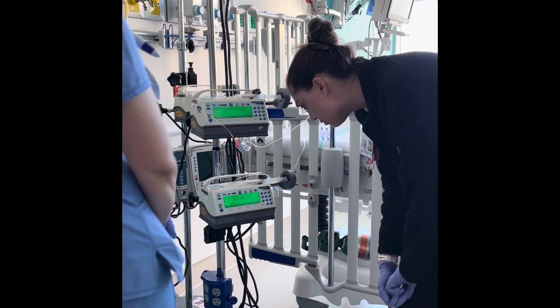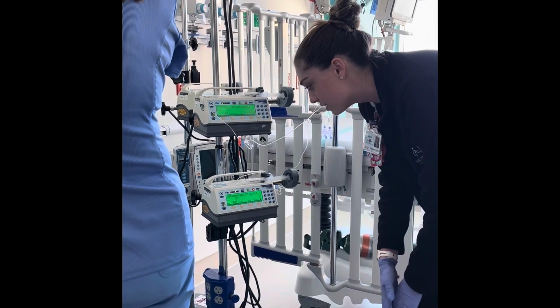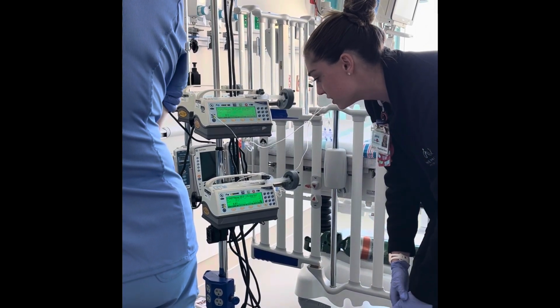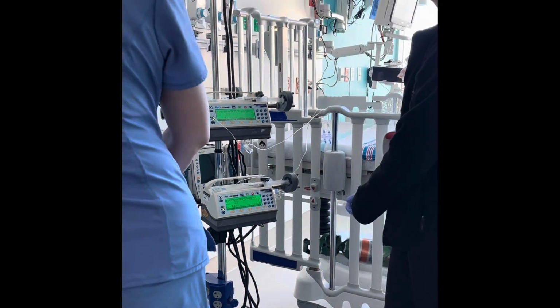Mikey Mouse, 1, 2, 3, 4, 5, 6, 7. Epinephrine, 25 mics per mL. Weight is 10, dose is 0.03 mic per kilo per minute. Rate is 0.72 mLs an hour. Correct.